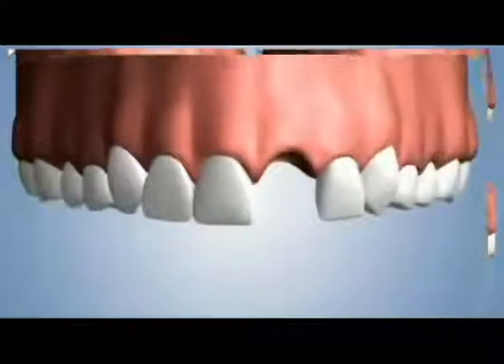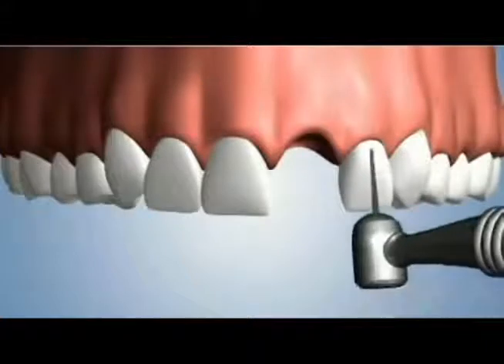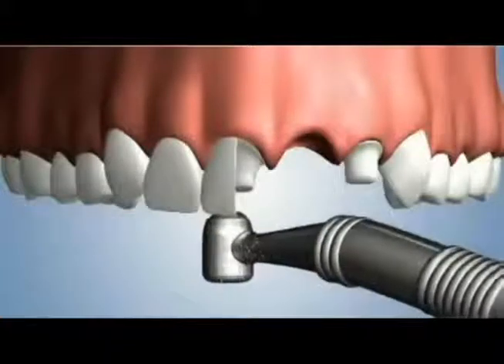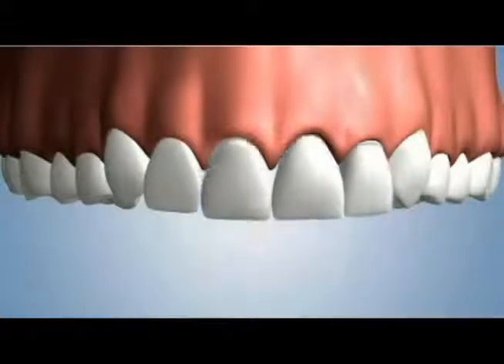The third option is referred to as a fixed bridge. A high-speed drill shaves down a significant amount of the neighboring teeth's natural structure. This prepares the teeth for the fitting of a fabricated 3-unit bridge that is cemented in place.